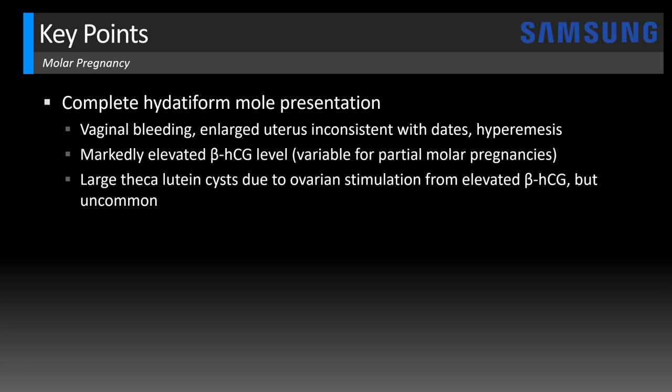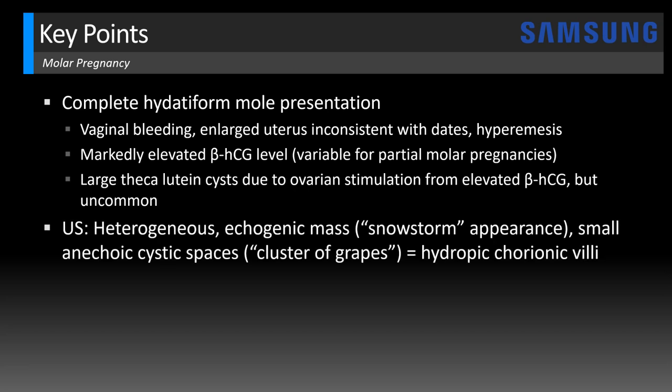You might also see large functional thecalutein cysts within the ovaries due to ovarian hyperstimulation from the markedly elevated beta-HCG level in a complete molar pregnancy. Those will be large cysts arranged in a spokewheel pattern throughout the ovary, but these are actually uncommon — we only see them in less than 20% of complete moles. This patient actually had normal ovaries. On ultrasound, we're looking for a heterogeneous echogenic mass expanding the endometrial cavity, giving almost a snowstorm appearance, within which you'll see small anechoic cystic spaces, as we saw in this case, giving a cluster of grapes appearance.